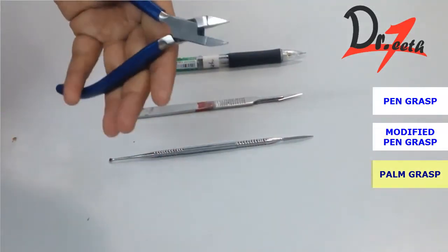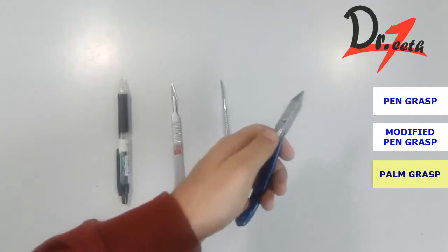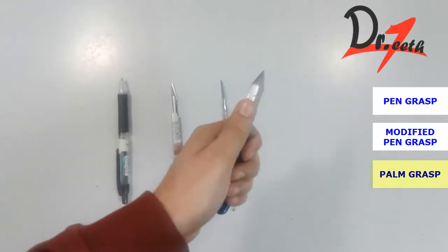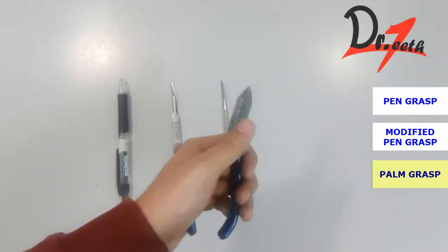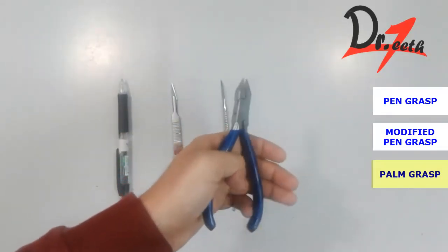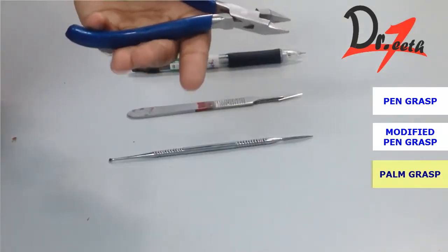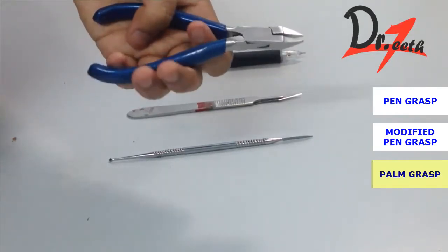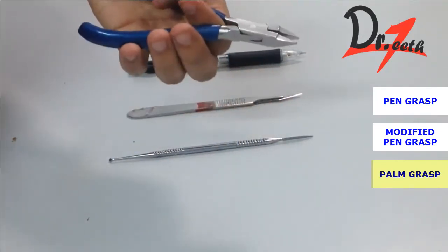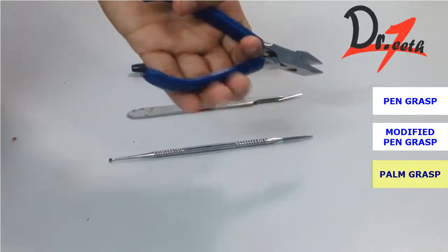Palm grasp is used where large force is required, like orthodontic pliers, extraction forceps and air water syringe. In general, the holding technique is as such, and for opening and closing, when we have to extract a tooth or bend a wire, it is used in this way, and for opening and closing we use this small finger to open the plier. We usually don't use this index finger because while snapping a tooth or closing the plier, we may hurt ourselves by pressing our index finger very hard.